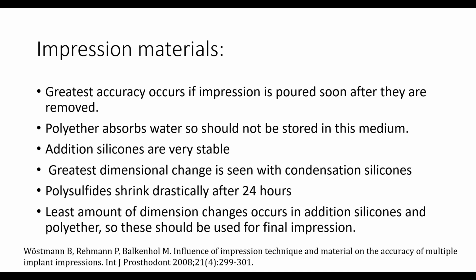The least amount of dimensional change occurs in addition silicone and polyether, so they can be used as the final impression material.